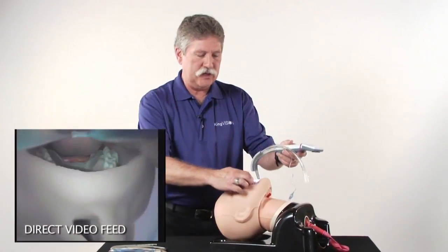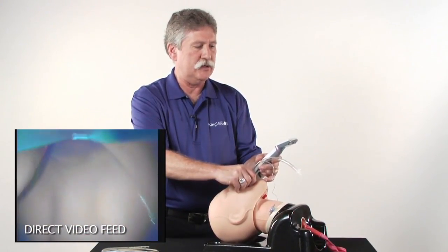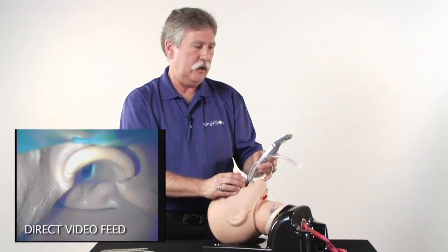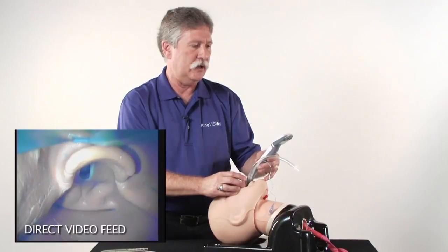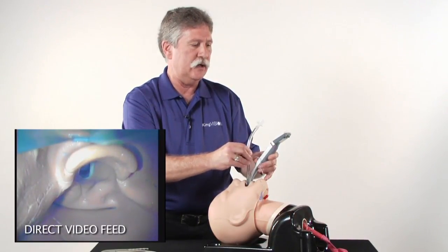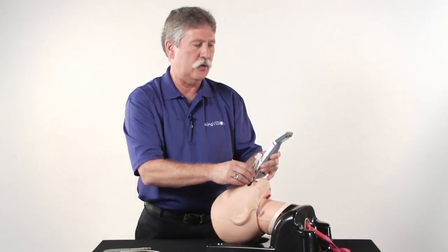In introducing the channel blade into the mouth, as we've talked about previously, it's good to follow the base of the tongue and visualize the epiglottis and even put the tip in the vallecula, much like a Macintosh blade. As you advance the tube, you can get a little fine control to advance the tube and center it so that it goes towards the vocal cords.